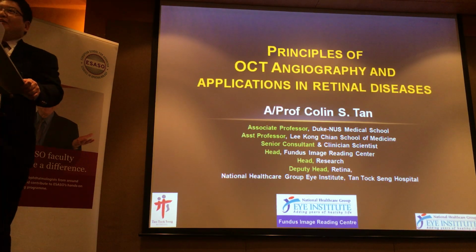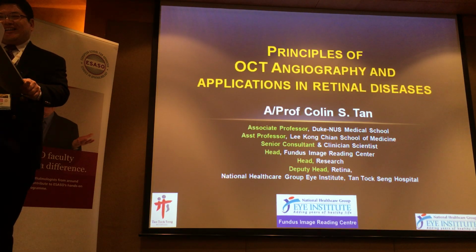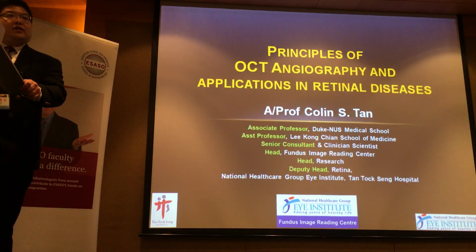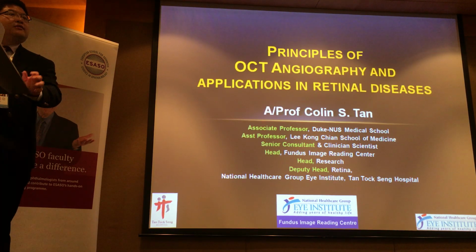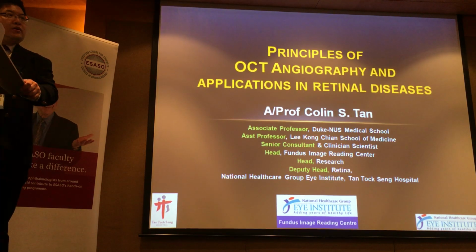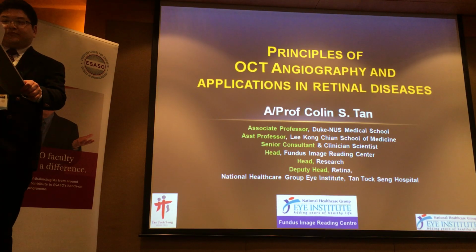Okay. So, well, for good or for bad, you're kind of stuck with me this morning. I'll be starting off the first lecture on the principles of OCT-Angiography and how this can apply to retinal diseases. Now, OCT-Angiography is of course available now, but it's only come out in the last few years, and it's a technology that we are still learning about. It's exciting, it's very useful, but I think we still have much to learn about this, and we need to be careful how we apply this.